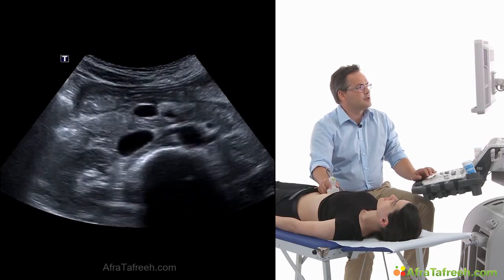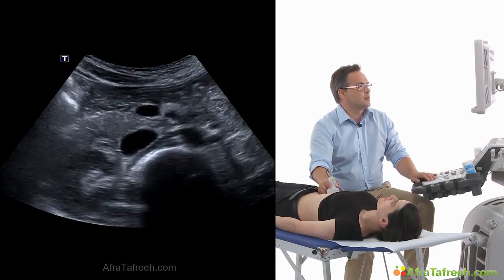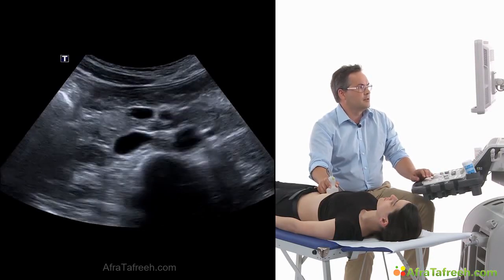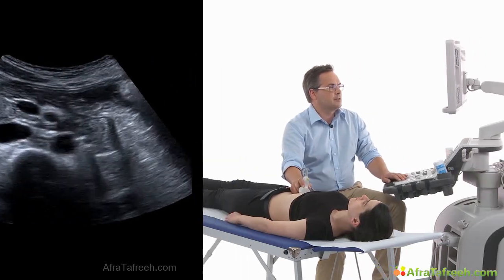And we can follow these arteries quite well, depending on the conditions of our examination. Over here on the right side, and on the other side towards the left kidney.